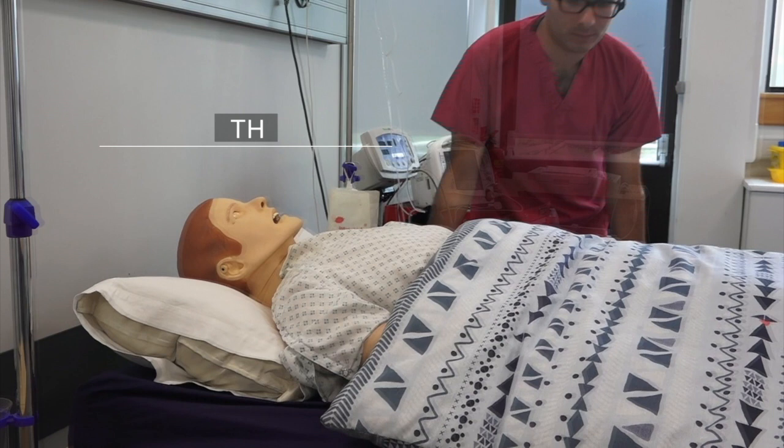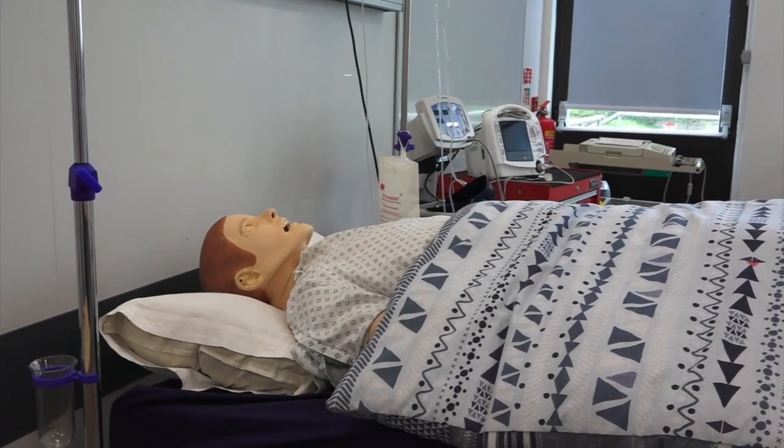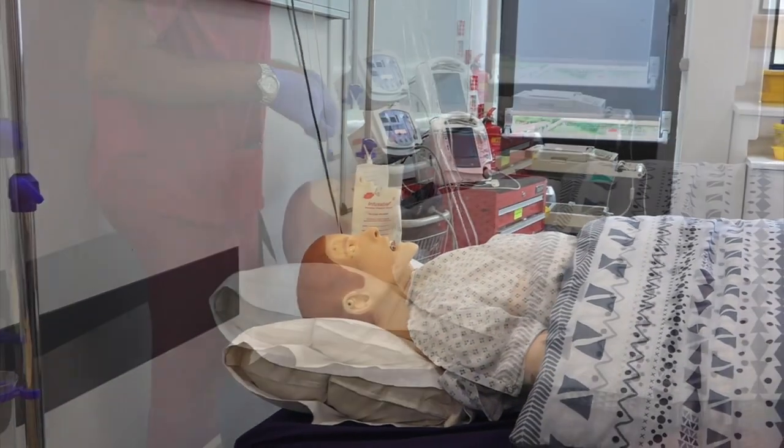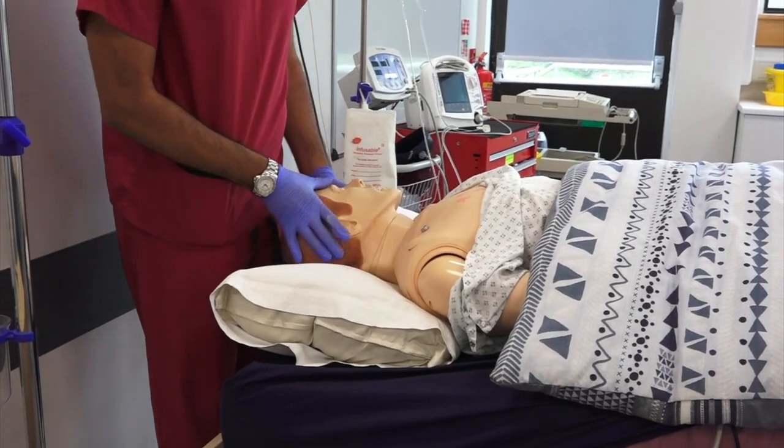Position the patient for cannulation. The appropriate position is head down, supine, and with the head rotated slightly to the left. If the patient cannot be positioned head down due to high intracranial pressure or severe heart failure, consider an alternative approach.